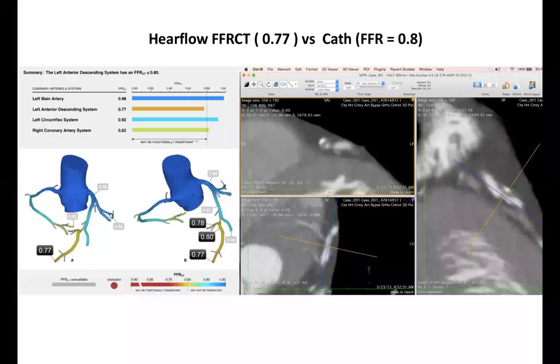As you can imagine, when they were getting FDA approval for this method, they did many such studies where they predicted what the FFR would be in a patient, and then they go to the cath lab and measure the FFR with a catheter. And when they were getting their answers wrong in the initial phases of this company, they modified their segmentation and their modeling such that they got a closer match. They learned from that data. And fairly soon, my prediction would be that they'll just take this coronary angiography data with CTA, feed it to a deep learning model, and come up with these FFR predictions.